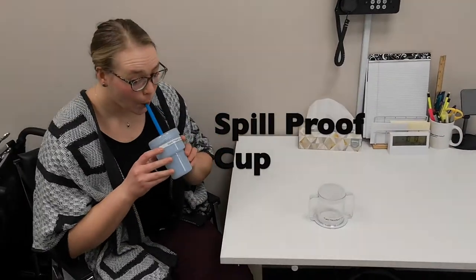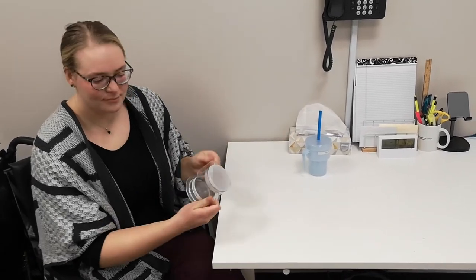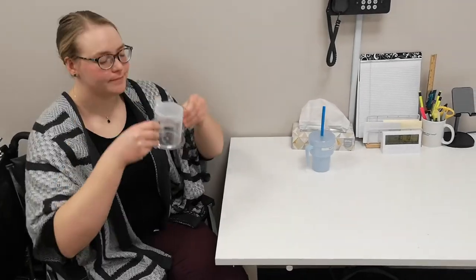A spill-proof cup or a cup with handles is useful for individuals who find it difficult to drink from a regular cup without spilling due to tremors or weakness.